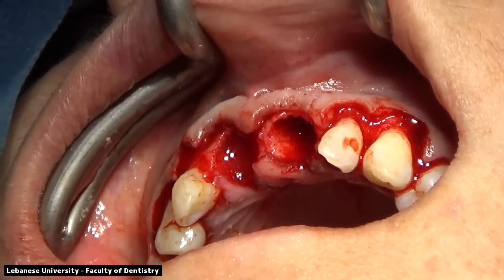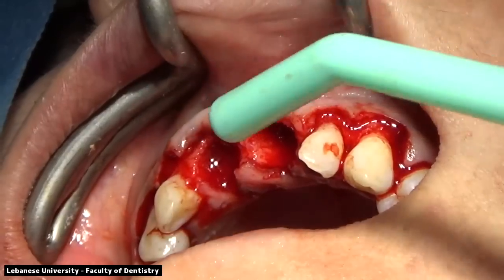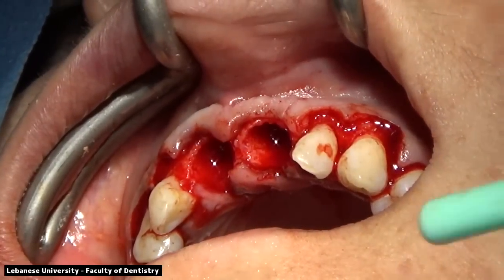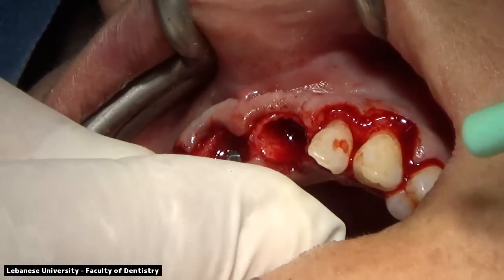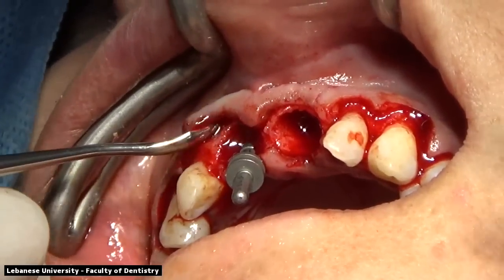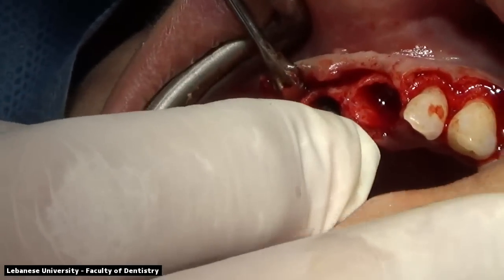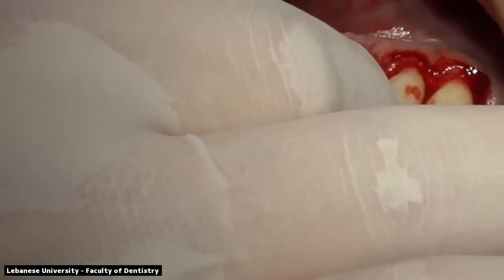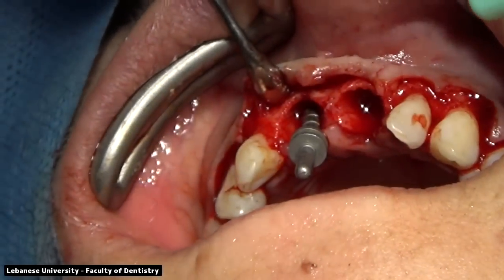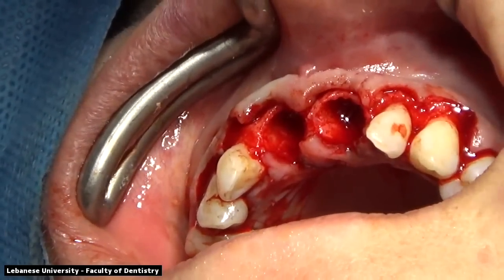So the head of the implant will be directed more buccally, but the tip of the burr will be at the palatal aspect. So when we're putting our guide, after we did our pilot drill, what we notice is that the guide pin is placed slightly towards the palatal. We're going to engage it a bit to the buccal, and we need to go a bit deeper on this implant site.